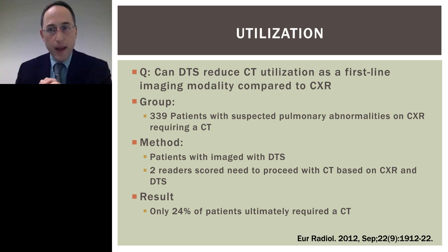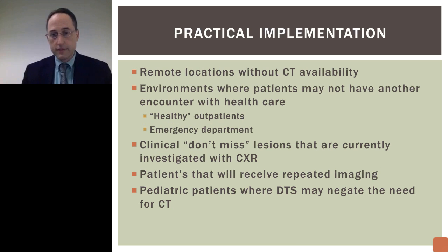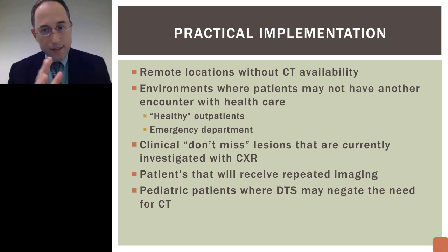That is a very dramatic drop in utilization, which frees up a resource, prevents a hospital from having to buy another CT scanner, decreases cost, reduces radiation. And I think that's a very powerful finding. Okay, so that's an evidence-based look at implementation.